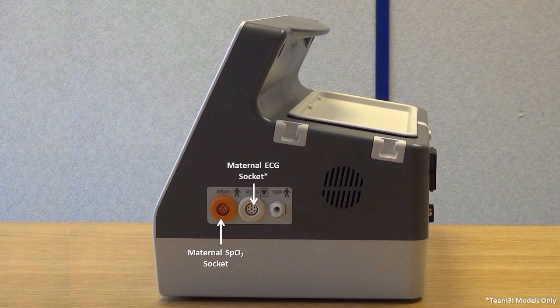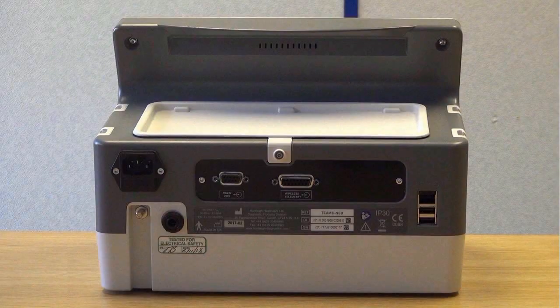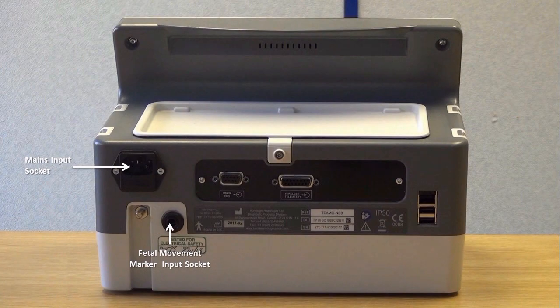The right side of the screen features a Maternal SPO2 socket, a Maternal ECG socket, a blood pressure connector, and two transducer mounting points with another two on the opposite side. The back of the unit features a mains input socket, a fetal movement marker input socket, and a serial port for communication with Sonicade software systems.